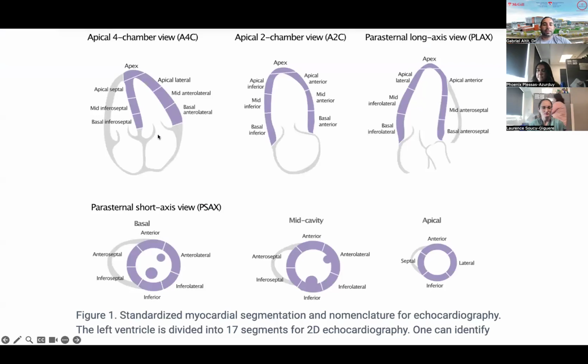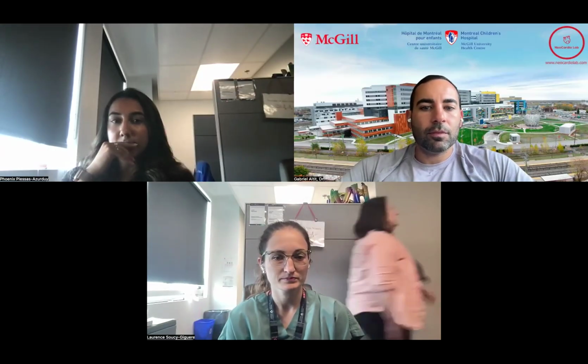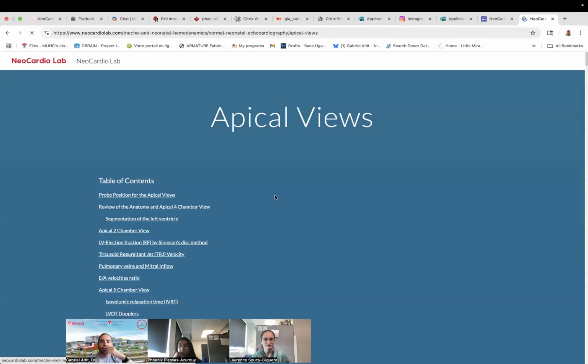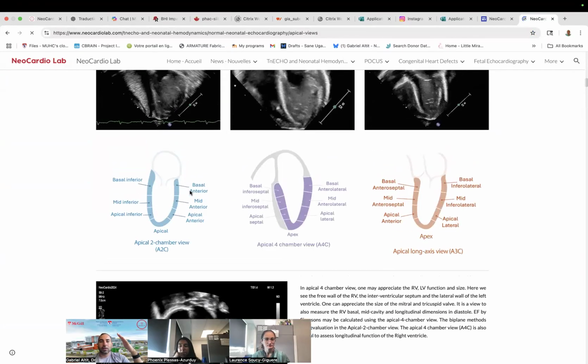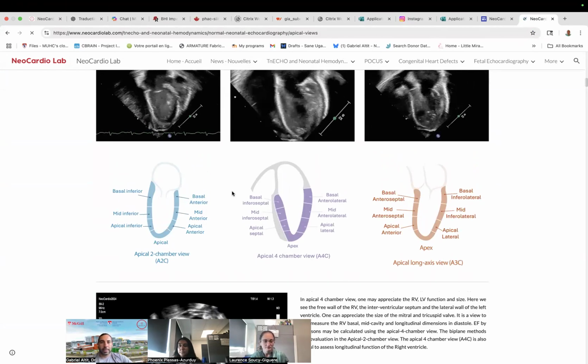I've put here some of the standards of the nomenclature, and I think I put it also on the website. I actually created a section, let me share the website so you can see. Oh, I'm going to lower my hand at the same time. So you should see the website. If you go here and you go to the apical view, a lot of what I'm saying is going to be outlined here. So I've provided you the regular nomenclature of the TNE world.